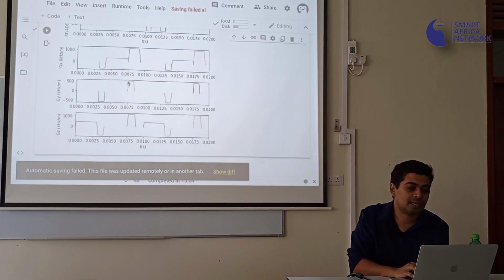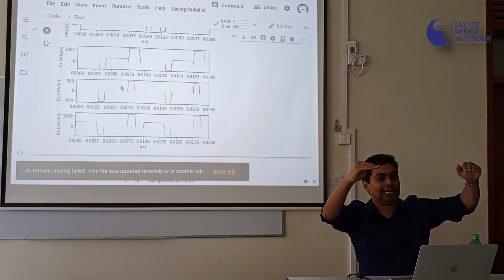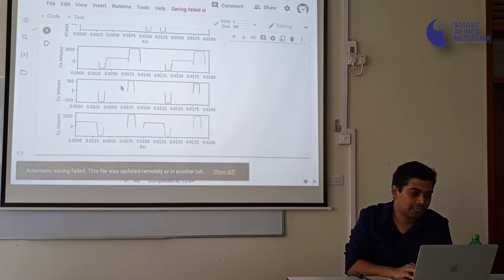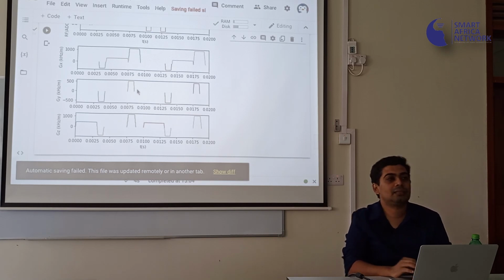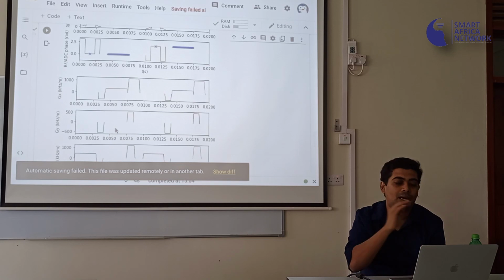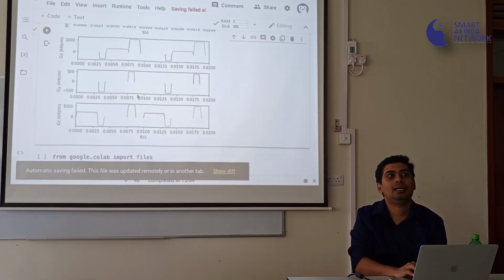That's all there is. And then once you've done that, remember we were at the top line, now we have to go to the next line. The way you go to the next line is by incrementing, or going one step up, in that other dimension. That's the second line. The third one is to select a part of the body, which is called slice selection. But that's pretty much it.